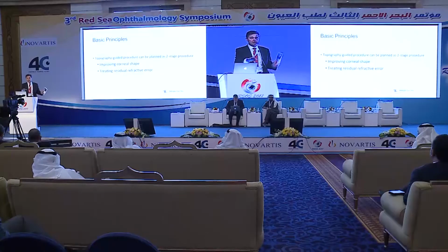When you're starting out with this, sometimes a good idea is to tell the patient this is going to be 2 stages. Number 1 is no refractive power, regularize the cornea, and wait 6 months to do the second part. As time goes on, when you start doing this, you might make a note on your chart: I'm doing the 0 power topography-guided part today. I've looked at the ablation and I'm making a prediction today. This is going to make the patient 1 diopter more myopic. And then in 6 months' time, you look at your prediction. Did it come true? With experience, you're going to start finding, I'm getting this right all the time.